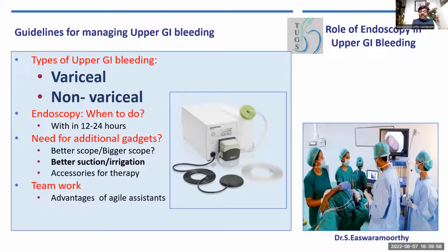But a better irrigation device is really a good one, and we know the importance. Of course, we need to have all the accessories ready. When we do the endoscopy, behind me will be a big tray with all these accessories available.